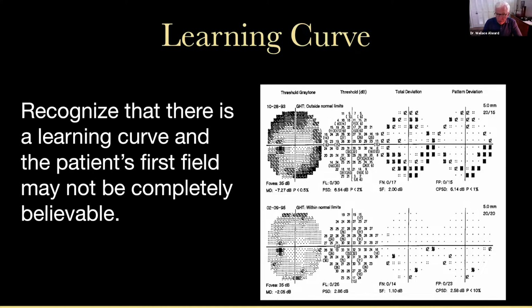One of the parts of our curriculum to teach our residents is all of our residents have to have a visual field performed on one of their eyes, just so they know what it's like, and partly so that they don't take somebody who just struggled doing Snellen acuity and put them in a perimeter. I mean, it is not something that's easy, and it's a lot less easy for people who are not sophisticated with computers and interacting with things that are computer-based and not human-based.